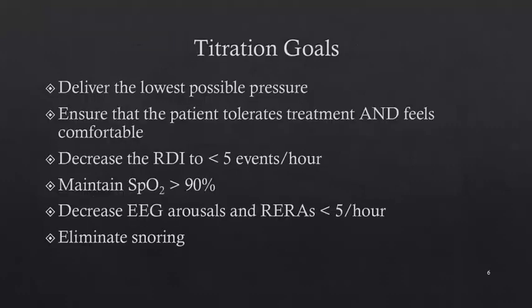Ideally, at the end of the night, we've got the patient treated. They are tolerating treatment, they're comfortable, and they're on the lowest possible pressure that gets their apneas completely eliminated. Their oxygenation is in an adequate, healthy range. Their arousal index is less than 5, so it's at a normal level, and ideally their snoring is also eliminated.